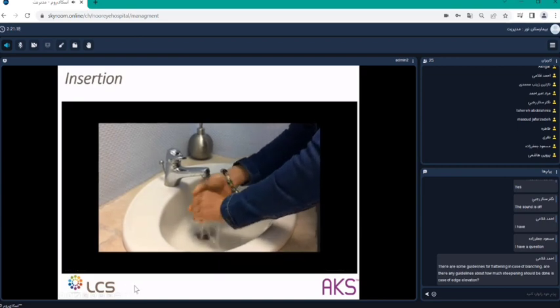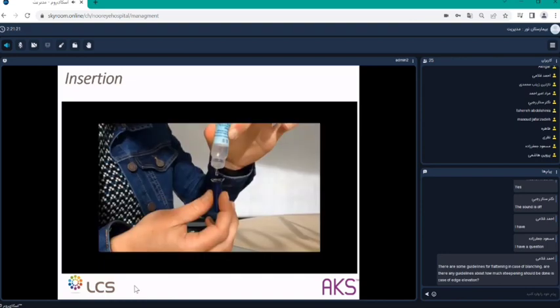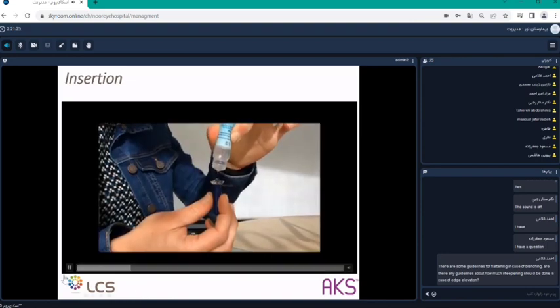Then, just to show you those videos, how to insert the lens. Of course, the lenses have to be filled with saline solution. What is also important is that you have to use a preservative-free saline solution, so no preservatives inside the liquid. That is very important, because you will have a global staining if the patient fills the lens with a saline solution that has preservatives in it. Doing that, you will have a diffuse staining in all the cornea.